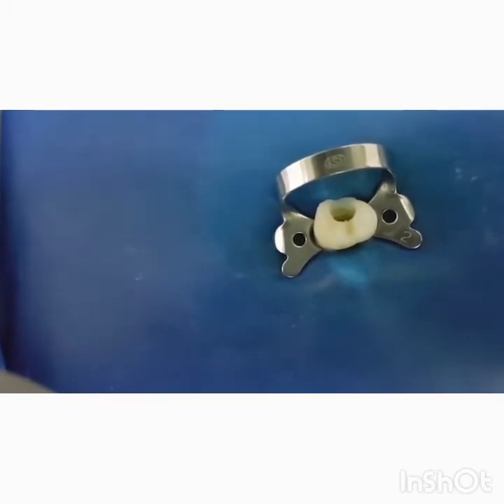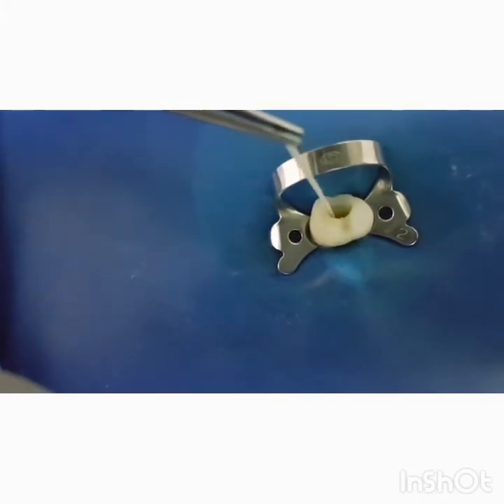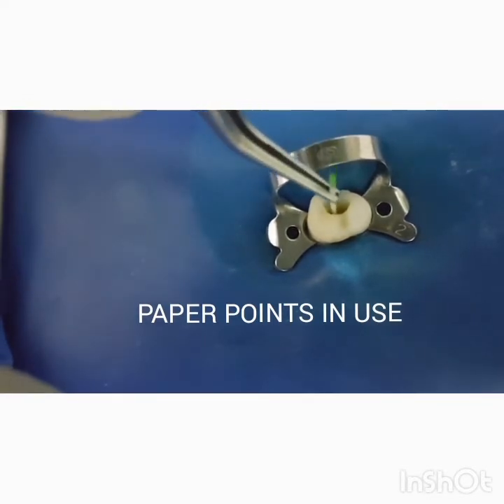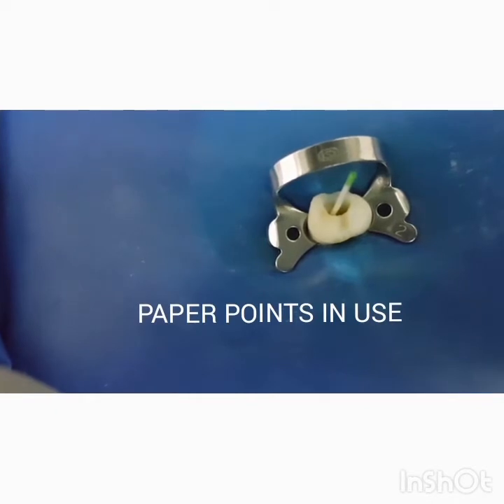This is followed by the actual drying with paper points. The standard recommendation suggests using large paper points to soak up or absorb maximum moisture from within the canals. You will notice that moisture is generally demonstrated mostly at the apical stop and the apical third of the canal wall.